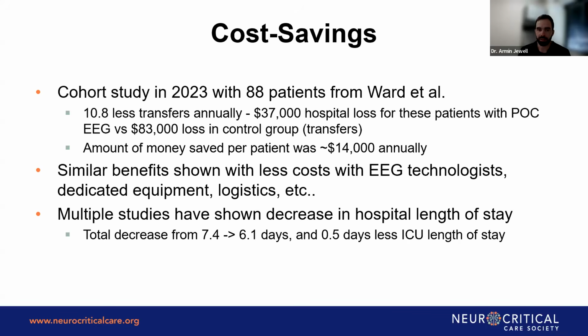Next, the cost. So cost savings, while there are, of course, costs associated with new technologies, there was a cohort study in 2023 that looked at these patients to look at point of care EEG to see if it would help with cost. And in general, with that one study, they showed almost 11 less transfers per year.